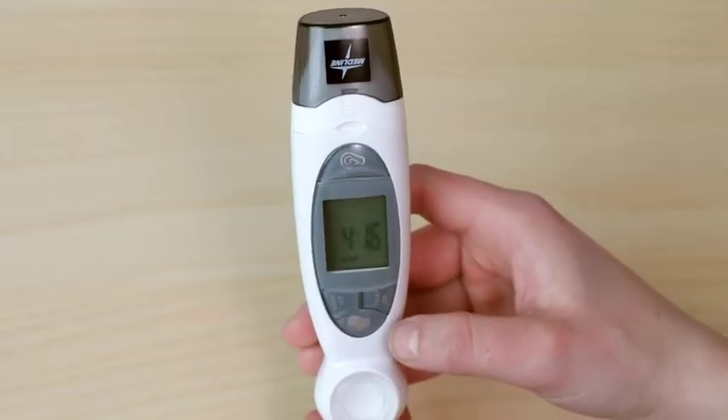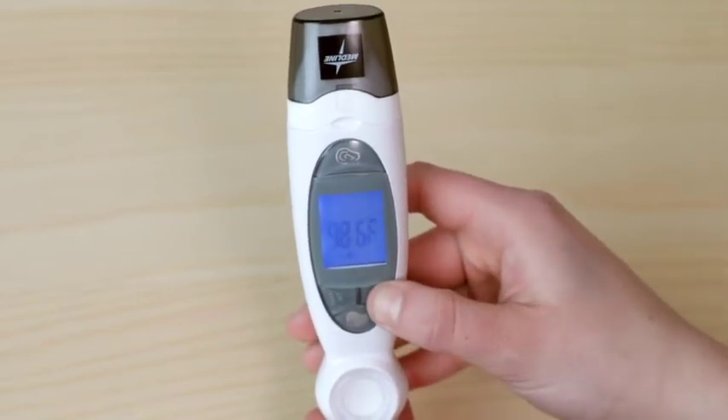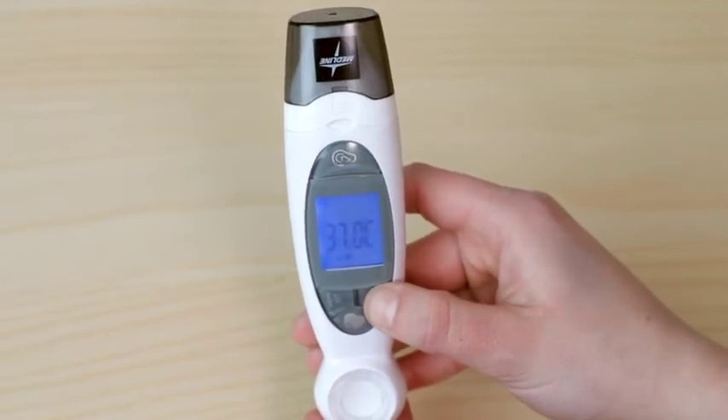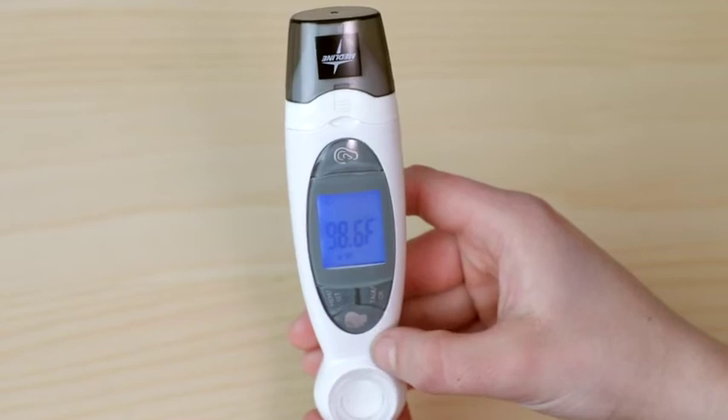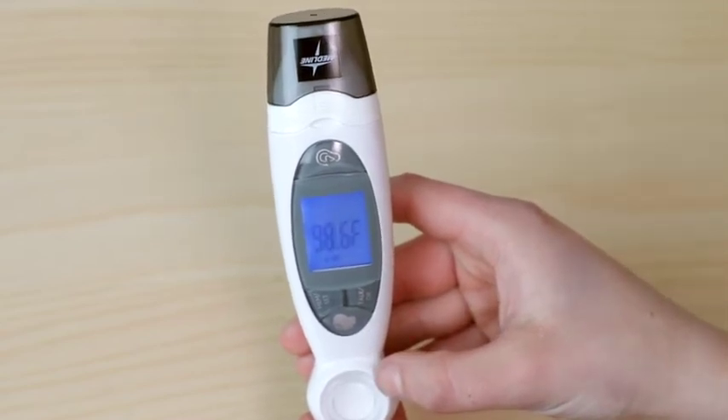In order to switch between Celsius and Fahrenheit, press the memory set button to enter memory mode. Next, press and hold the talk OK button to switch the temperature unit. This will change the units of the stored readings and show future measurements in the chosen unit.